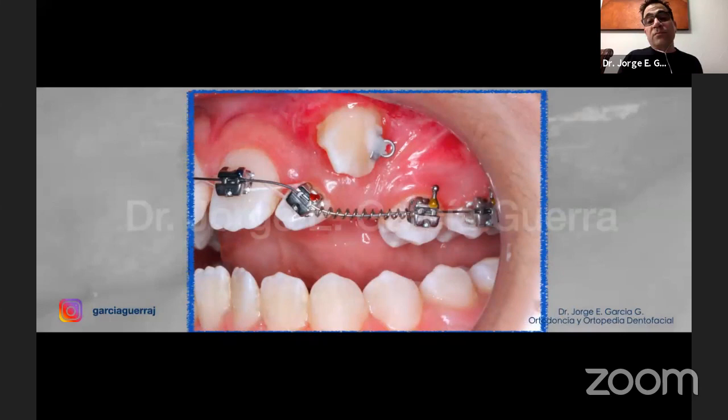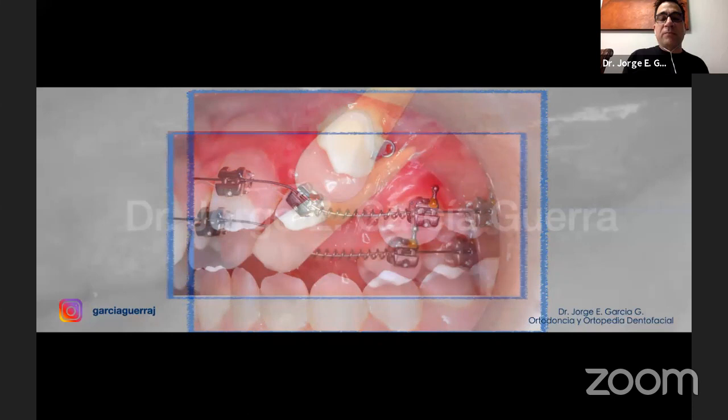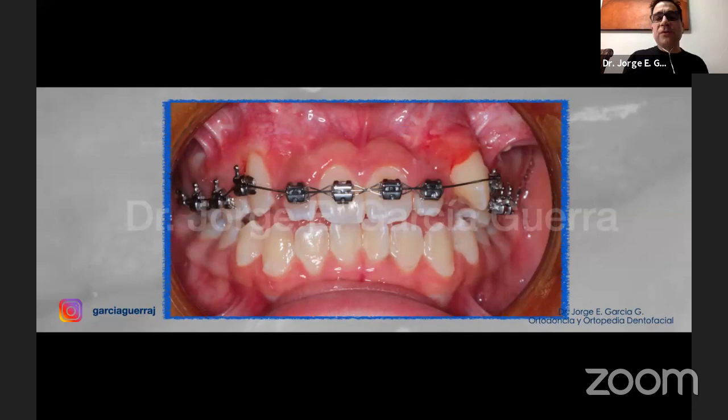Okay, now this is what we're doing here with some self-ligating brackets from 3M. This is a Gemini self-ligating bracket. And we're going to start to put the canine in the correct position. This is a situation that we had. Okay, now this is a few months into the treatment. We already got our canines. We're going to start to put them in the correct position.